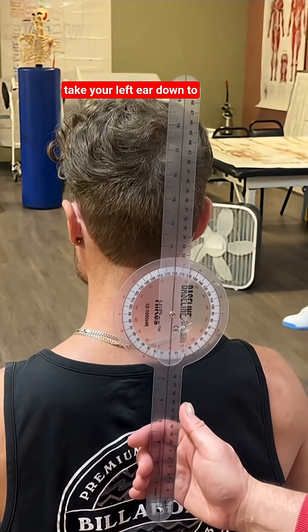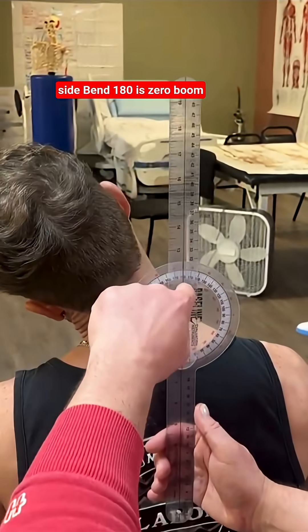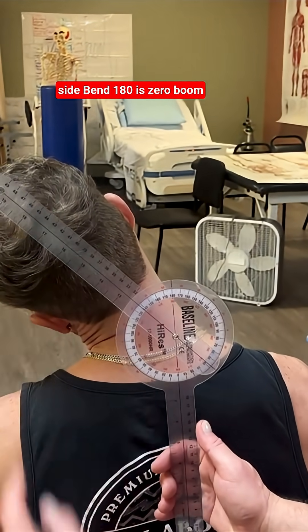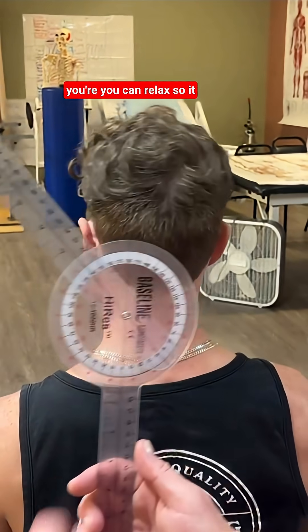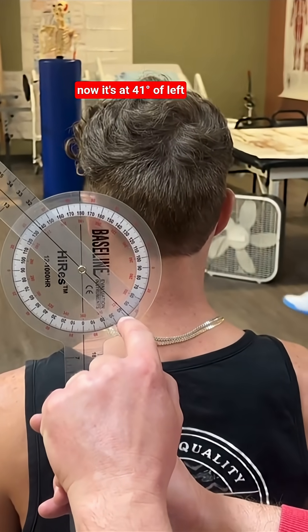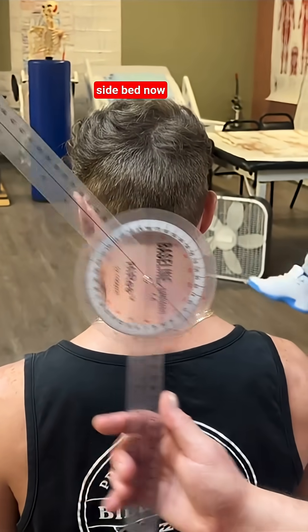Take your left ear down to your left shoulder. Remember, he's got a side bend — 180 is zero. You can relax. It also could be measured starting at zero. So now it's at 41 degrees of left side bend.